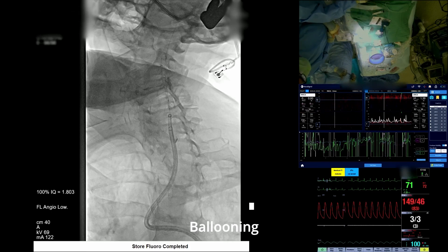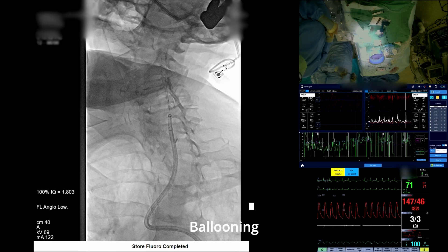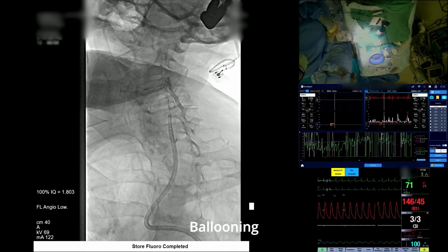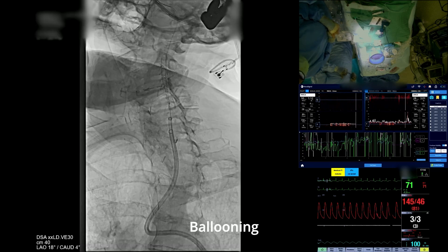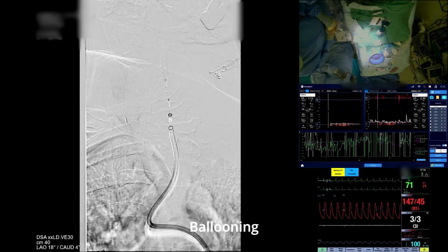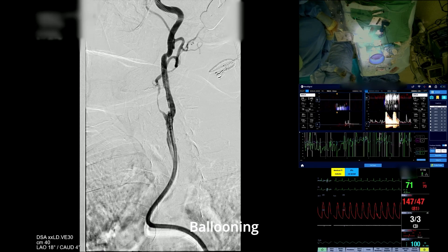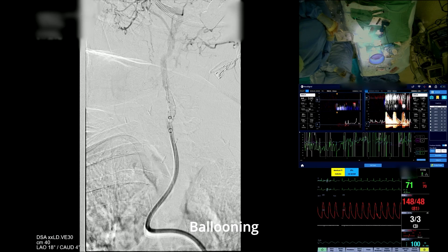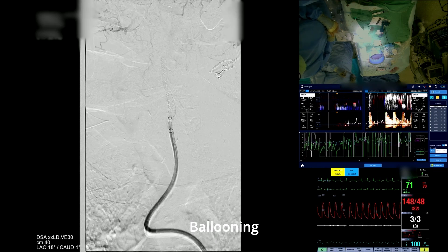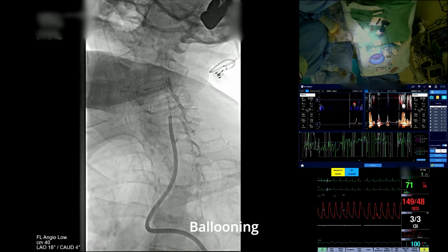The final angiogram revealed good stent patency and resolution of the stenosis, with the ECA still severely narrowed — of course, that was not manipulated.